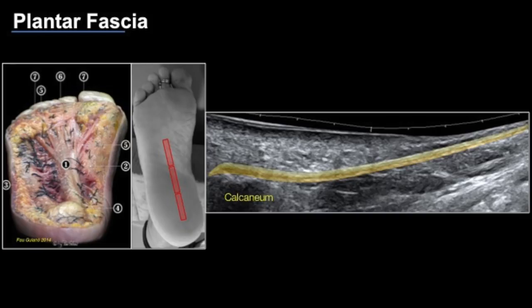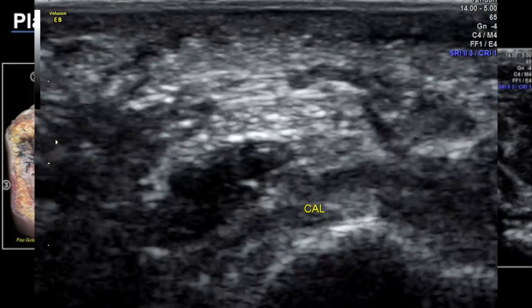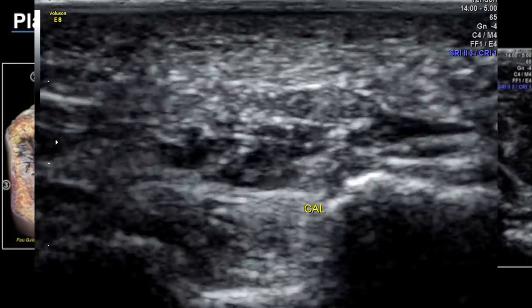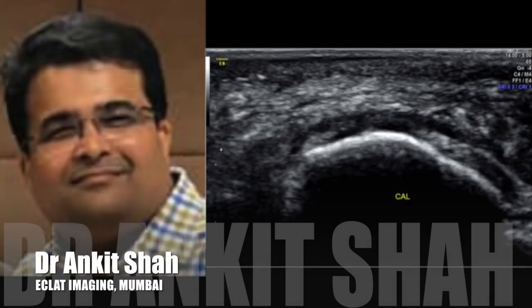On extended field-of-view, the plantar fascia is seen traversing from the posterior aspect of the foot anteriorly, becoming more superficial as it approaches the metatarsal heads. After evaluating on long axis, we also assess the plantar fascia on short axis so we don't miss focal areas of plantar fasciitis and can classify whether involvement is in the medial or lateral cord. With that, we are done with evaluation of the posterior ankle.